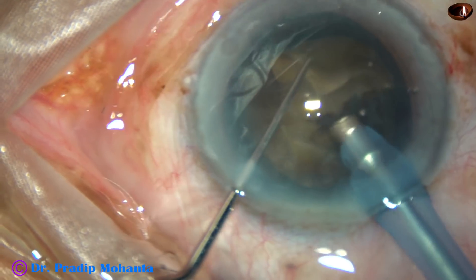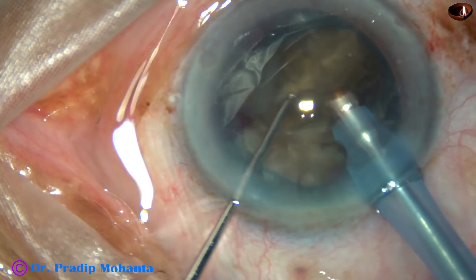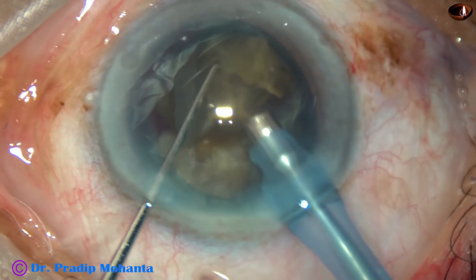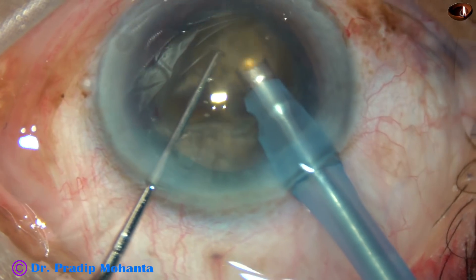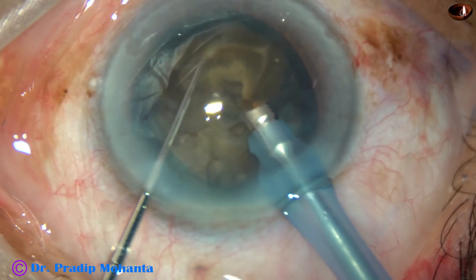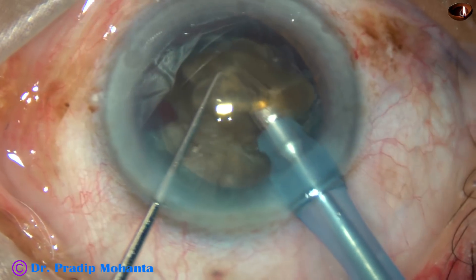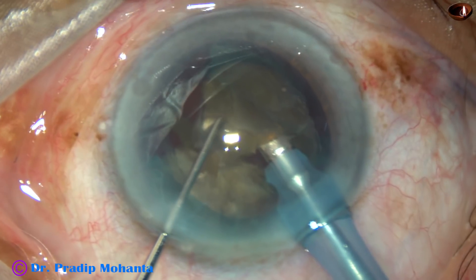FACO power being used in this case is 85%. Flow rate is 45 ml per minute. Vacuum is 450 mmHg. All the pieces are rotating nicely.